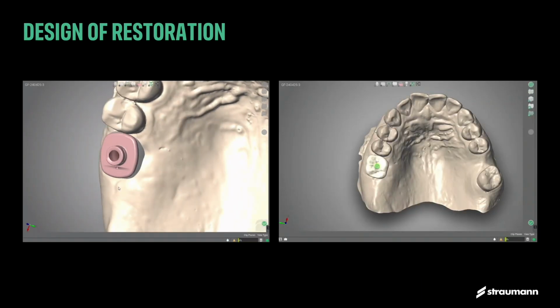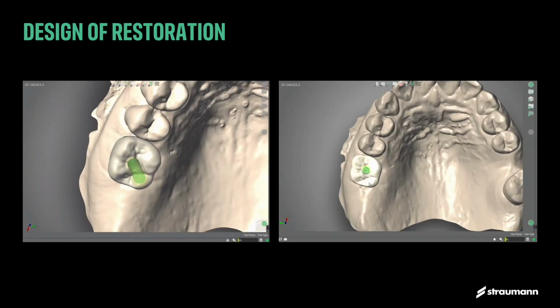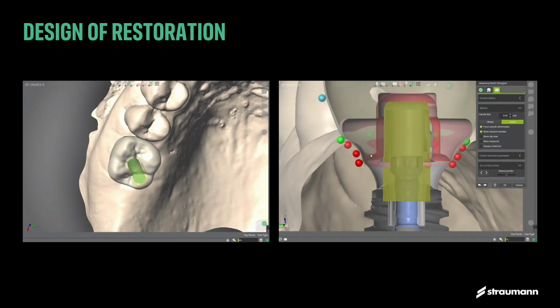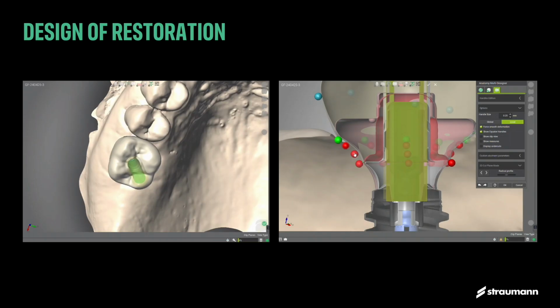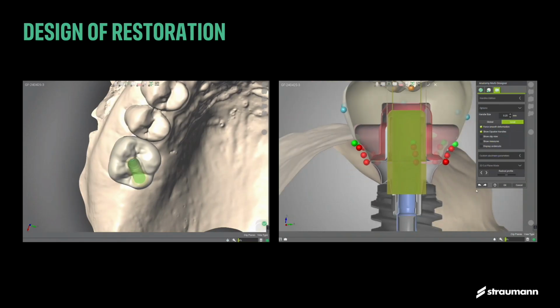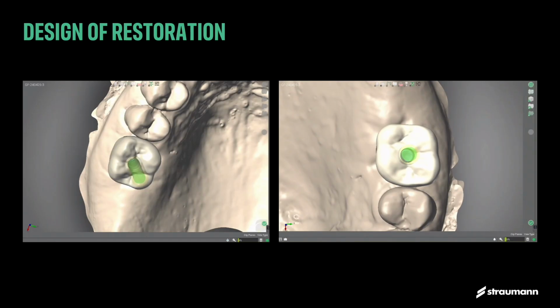This is already in the design software, and what you see on the right side, again, similar to the first patient, we're going to move this sideways, so there's a predefined shape of the gingival margin, just that emergence profile that we see already at the crown level, that we're going to do some fine tuning, so the new crown will never push and pull the soft tissue. It will be matching one-to-one the anatomic healing abutment and the shape of the future crown, and this is what you see from the occlusal view.